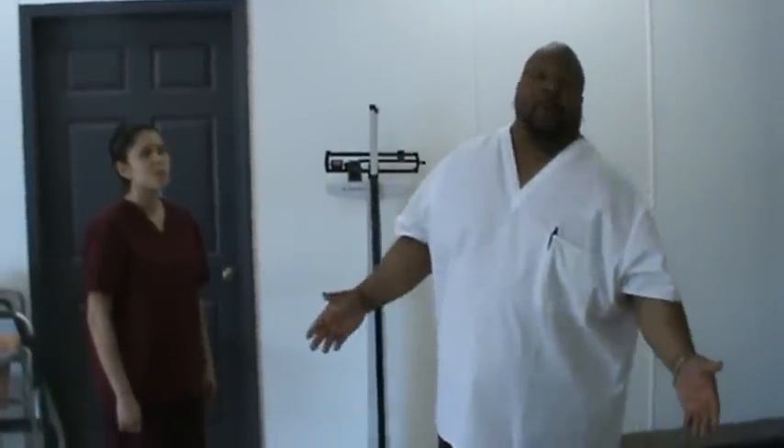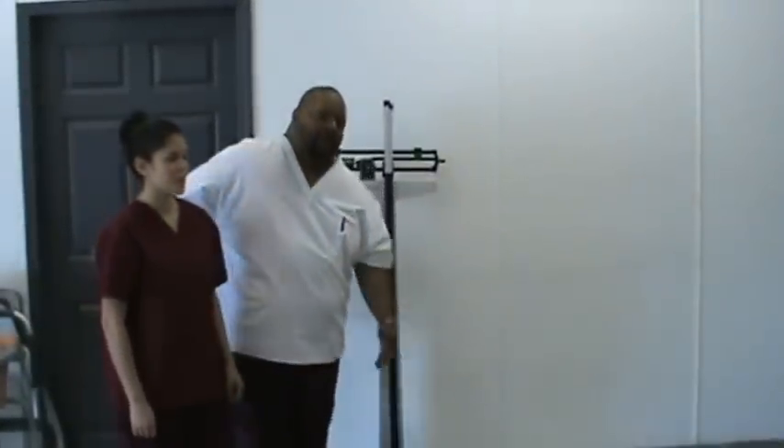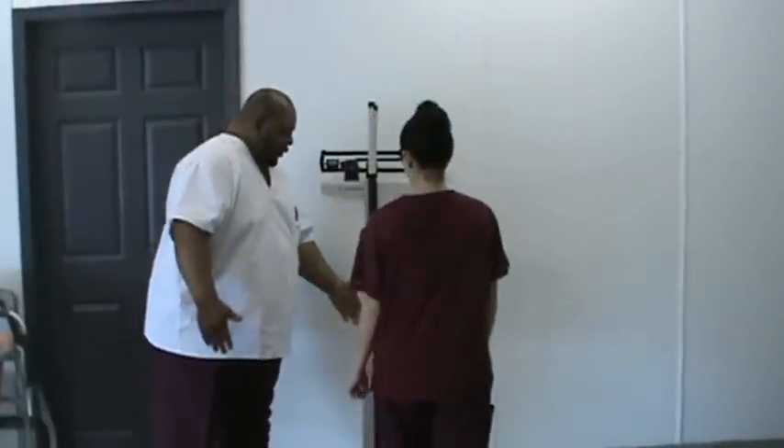By doing this skill, you might be asked to do an assessment or just be part of your daily duties. Now, my assistant here — what I'm going to ask her to do — she's going to step up on the scale.